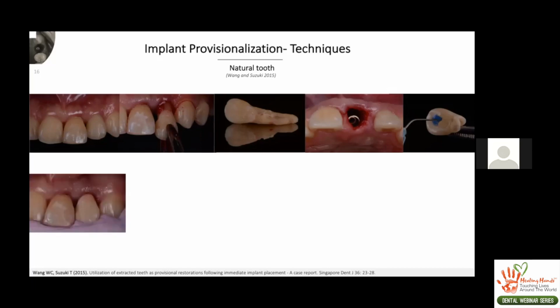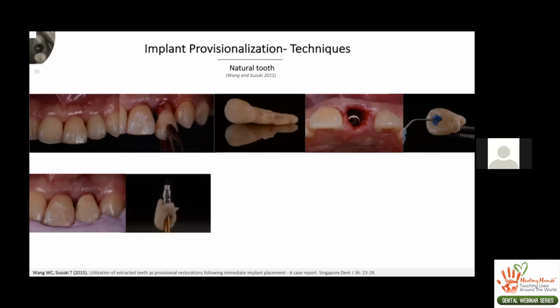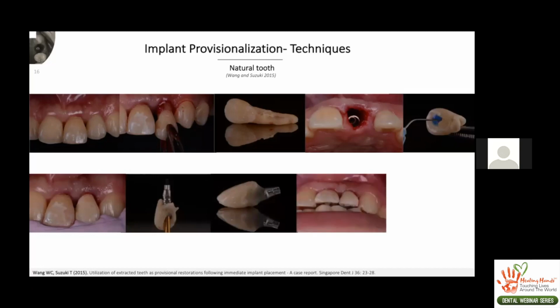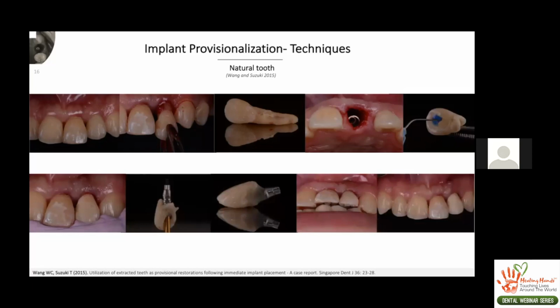And again, as I said, you can etch, bond and use resin. What's very helpful if you're going to use a natural tooth is to have a putty index or some sort of a matrix that will help you reposition that tooth exactly where you had it before you place the implant. Once again, you're going to add a temporary abutment or a custom abutment to the implant that you are trying to provisionalize, and then place the tooth around it and use some resin material to basically pick it up. And then eventually, chairside or in the laboratory, you are going to modify the subcritical and critical contours, as we were talking about, to be able to achieve the desired gingival margin. And then you can go ahead and insert it on the implant. So once again, I think natural tooth is a really good method to provisionalize an implant, if you are in a situation where you are able to retrieve the natural tooth.